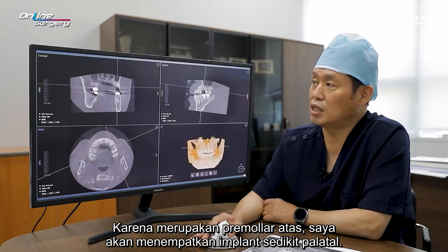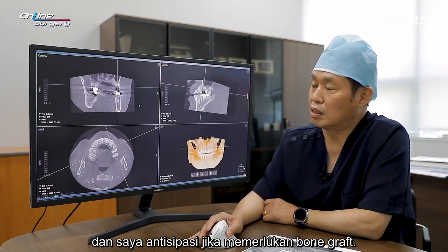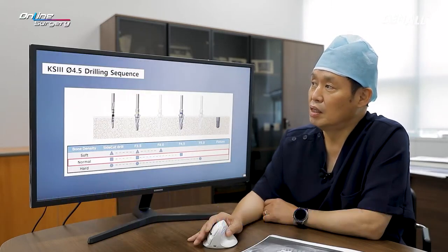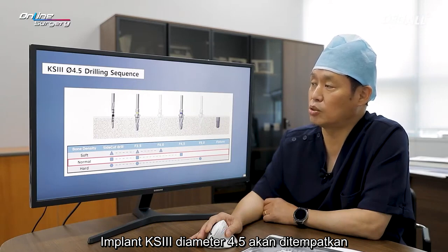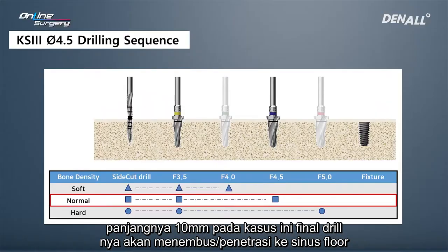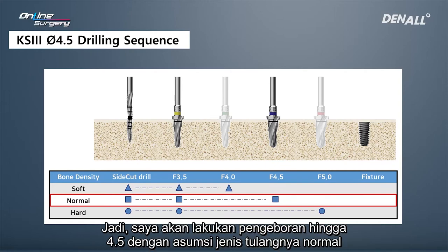Because it is an upper premolar, I'm going to place the implant slightly palatally. In that case, there's going to be quite a significant gap on the buccal side, and I anticipate that there will be a need for a bone graft there. A KS3 4.5 implant will be placed. The length is going to be 10 millimeters. In this case, with the final drill, I'm going to penetrate the sinus floor. Therefore, I'm going to drill up to 4.0 or 4.5, assuming that this is normal bone.